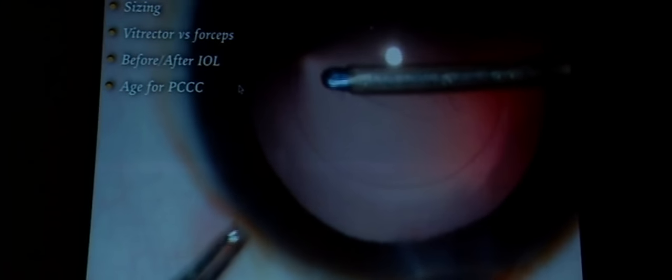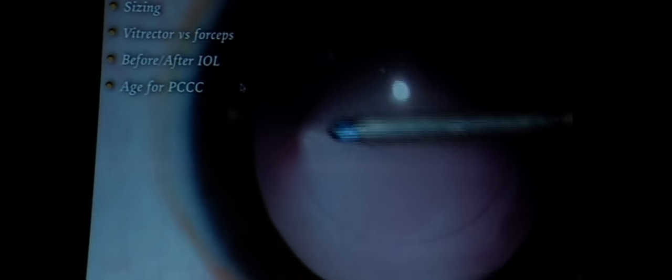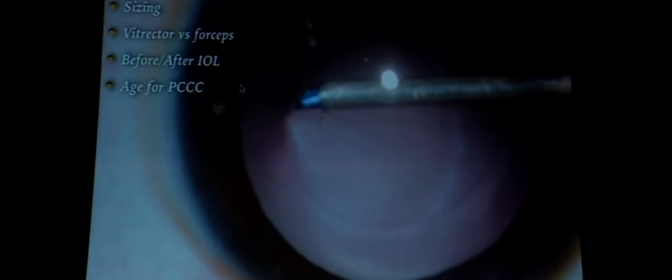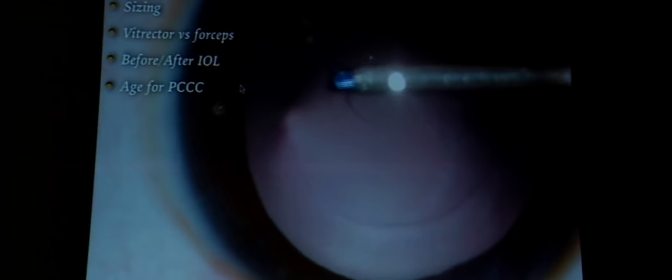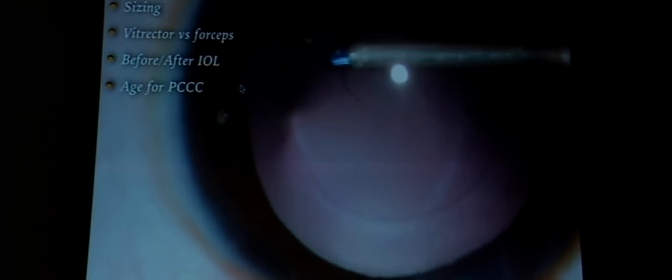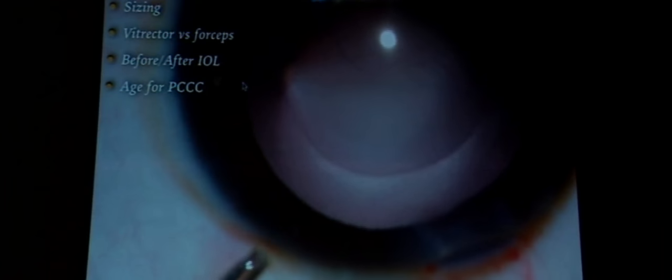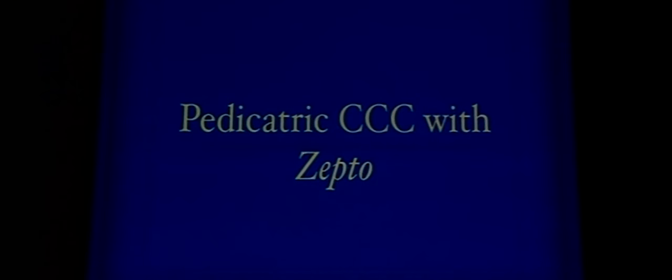Some surgeons prefer to do the posterior capsulotomy after placing the lens, going around the IOL, or even via a pars plana approach to make the opening — all are acceptable as long as an intact posterior capsulotomy is achieved. Lately, I have been using the Zepto device to make capsulotomies and have found it very useful because it gives a perfectly round rhexis of appropriate size, which can be difficult to achieve in a pediatric eye.